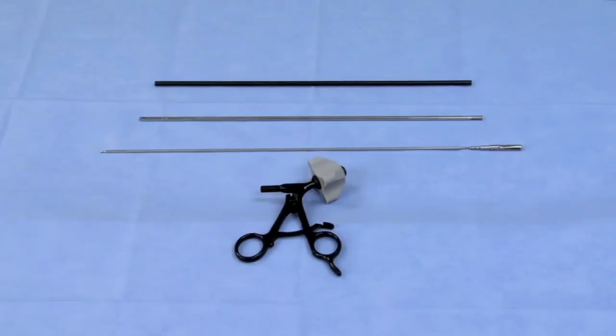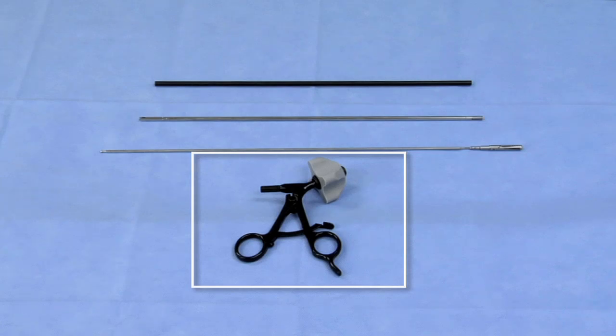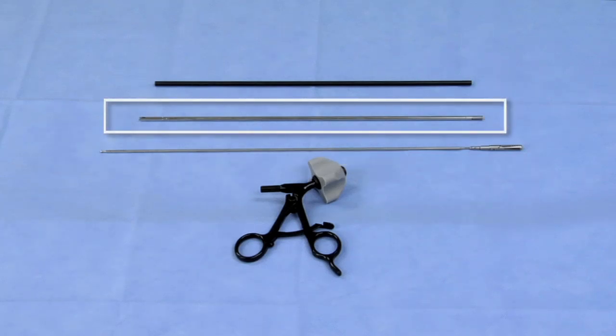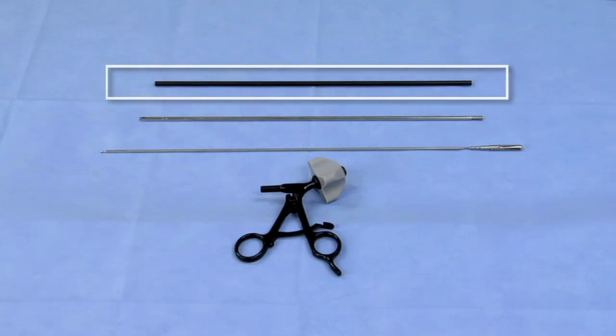Esculap Sovereign laparoscopic instruments are comprised of the following components: handle with rotation knob and handle buttons, jaw insert, inner metal tube, and outer insulation tube.